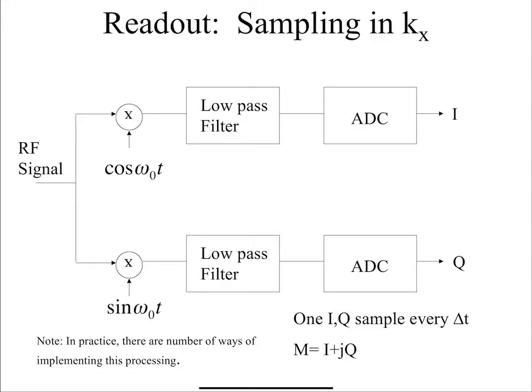So let's now talk about how we actually design this and how we apply this to real-world MRI. So the first thing we're going to do is talk about readout. So we'll do a few slides on this and then give you guys an exercise to do.